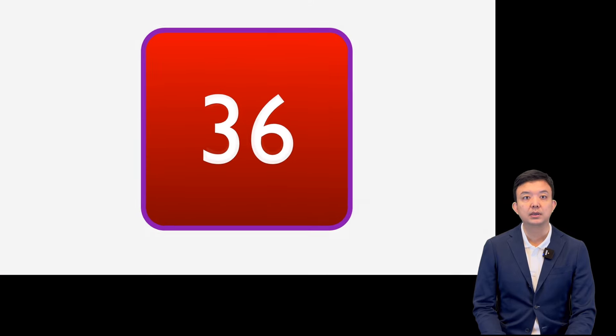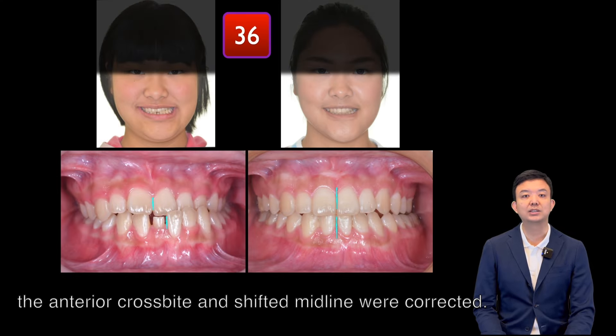36 months later, the anterior cross-bite and midline shift was corrected.